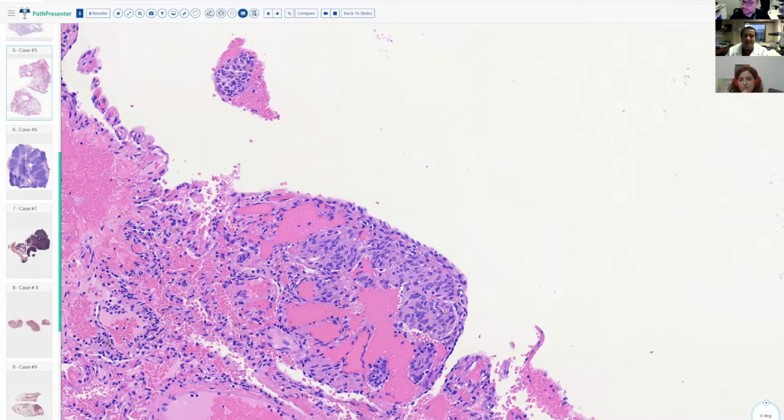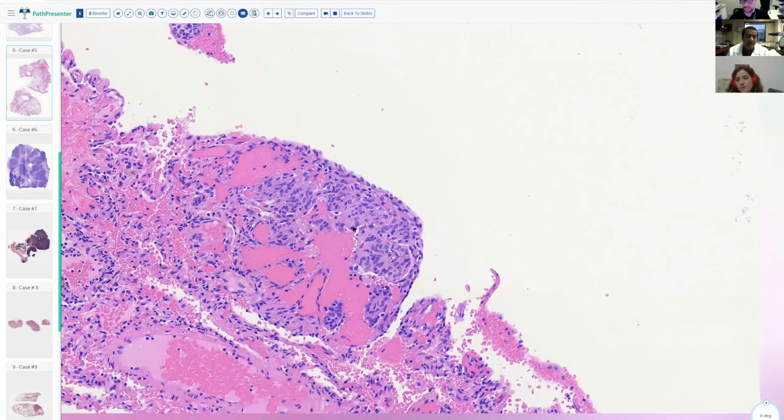The problem with cathepsin K is that it's relatively new for this, so you don't really know what else could stain for cathepsin K besides this. But it's claimed, and at least in my experience it's true, that it doesn't mark other things, and it marks these PEComatous lesions. So that's another thing you could do in those negative cases. I also use progesterone receptors, I think just to highlight the cells. Just one thing on that: other things in the differential, like a metastatic endometrial stromal sarcoma or a benign metastasizing leiomyoma, are also positive for ER and PR. So you have to look out for that. It's not a specific marker.